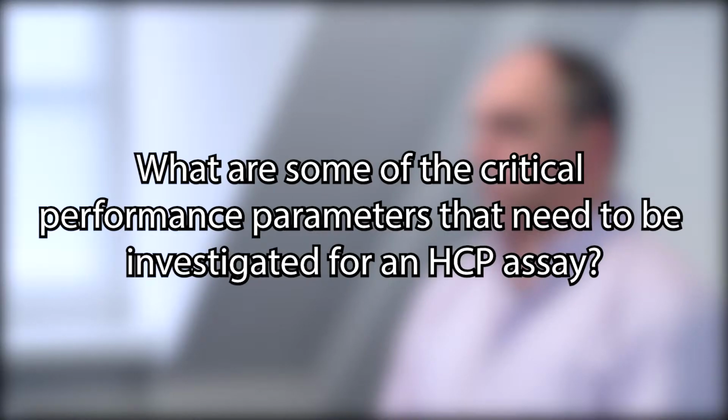What are some of the critical performance parameters that need to be investigated for an HCP assay? Some of the critical parameters for development of an HCP assay are common to other assays. In this case, the matrix effects of the different buffer systems are important. This assay is going to see samples that come from very far upstream in the bioprocessing workflow all the way to final product.